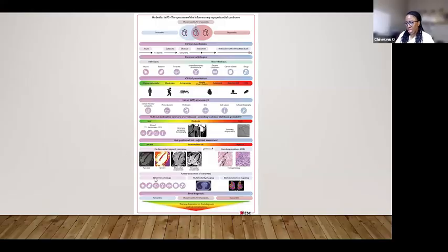Really we should be putting them forward for a cardiac MRI scan because we'll be able to say what the diagnosis is. If people have come in with typical symptoms, elevated troponin, and normal, non-obstructed coronary arteries, they have myocardial inflammation of unknown cause. Now, it could be acute myocarditis, it could be Takotsubo, stress cardiomyopathy, so these are the factors that we would want to tease apart with cardiac MRI, and we are grateful that it can actually give us that information.